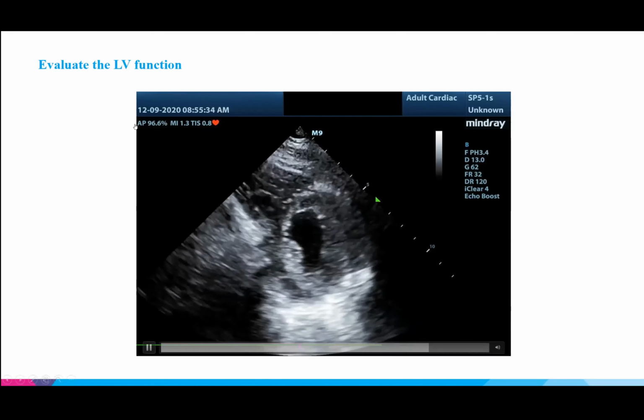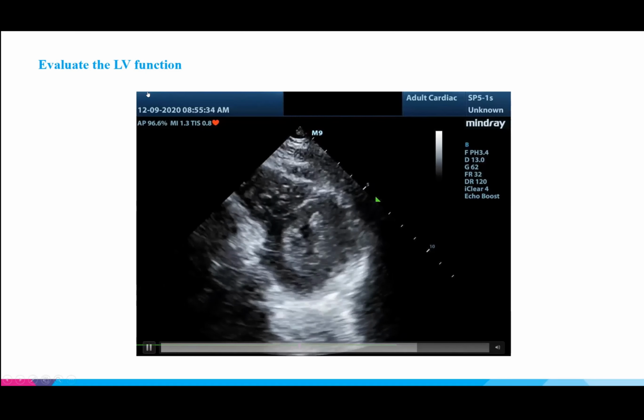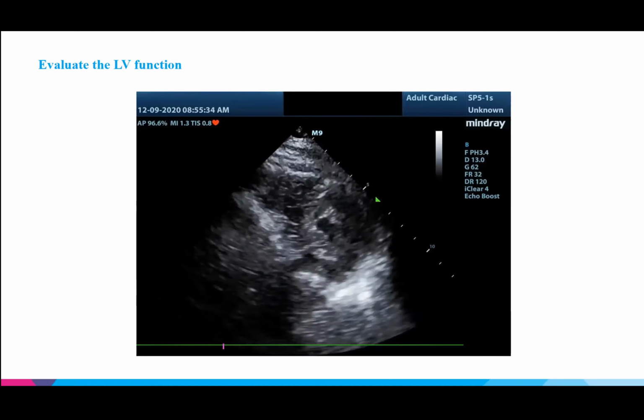So yeah, this is... I will say I don't know if I did this one. I can't remember who did this view. I don't know, so I don't want to take credit or bash anyone.